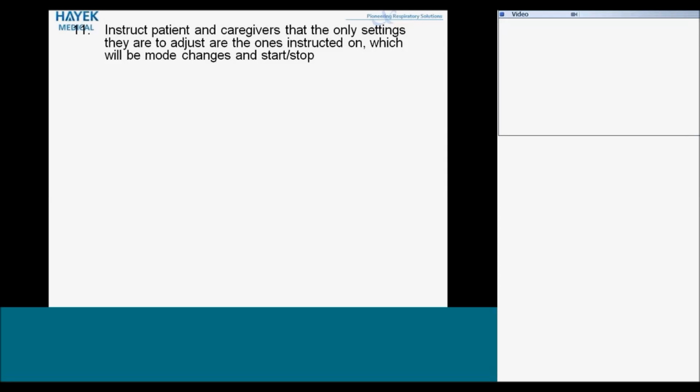And if the patient's not ordered on them, he's just ordered on continuous negative, set them to some moderate settings, say, for example, -18 +6 at a rate that's normal for the patient's size and age. And that way, if they happen to fall into those settings by accident, it's not going to be anything that's extreme.